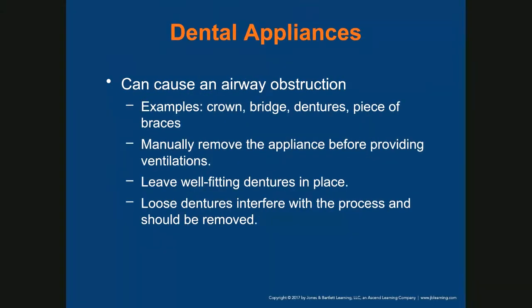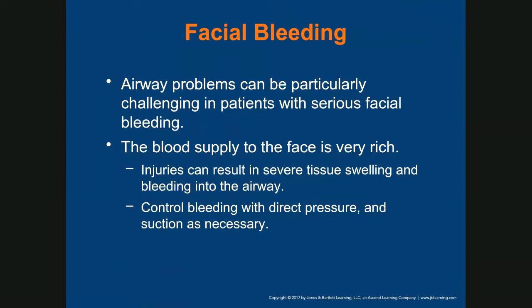All right, now for your dental appliances, it's also very straightforward. If it is firmly in place and you can use your equipment effectively and get the results that you want, leave the dental appliances in place. If your technique is being affected because the dental appliance is not in firmly or too loose, then you may have to take it out in order to better manage the patient. And that's basically airway management in a nutshell.